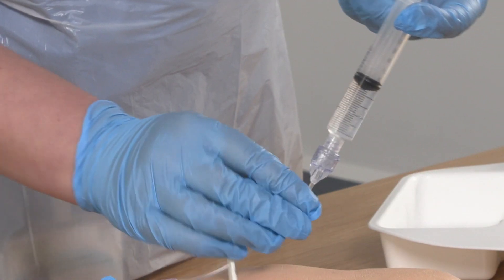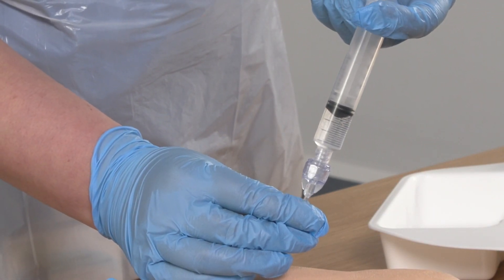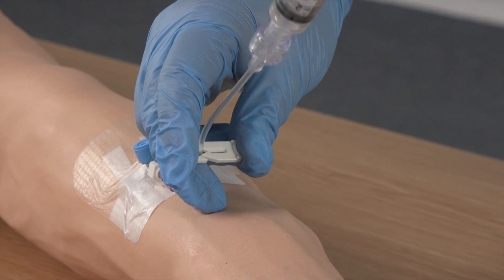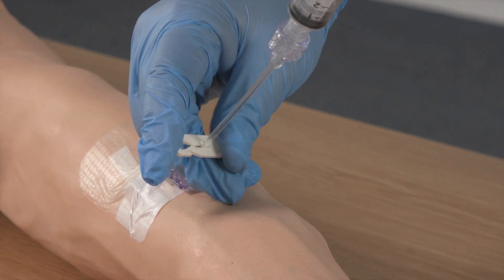The next step is to administer the flush using a really good pulsatile push-pause technique to create a turbulent flow. The turbulent flow removes any debris from the lumen of the device. During administration of the final millilitre of flush, the clamp is applied while continuing to push down on the plunger at the same time. This creates positive pressure. This last part of the flush technique — clamping the device under positive pressure — is to prevent reflux of blood into the tip of the vascular access device that could then coagulate and block the device.